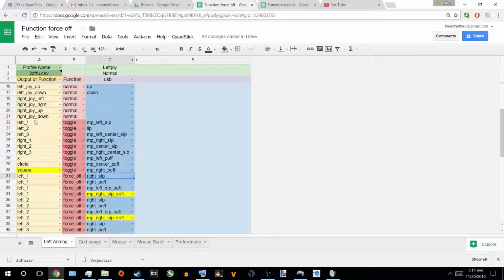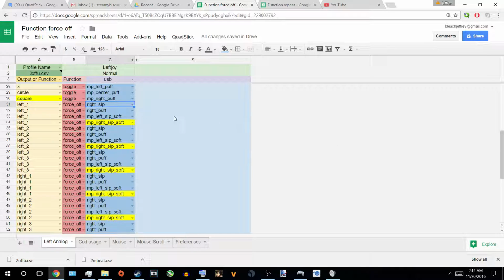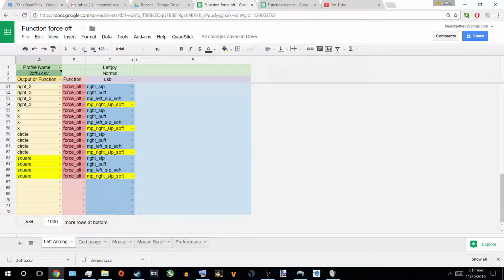So we have lines 22 all the way to 30 toggled. So if I scroll down, you notice left 1, left 2, left 3, and so on, all the way to square. And they all have the same commands. That's why you see a bunch of these highlighted stuff. That means I repeat the command. It's like a warning sign from Google telling me, hey, you're using multiple of the same commands. Is that what you want? In my case, yes.